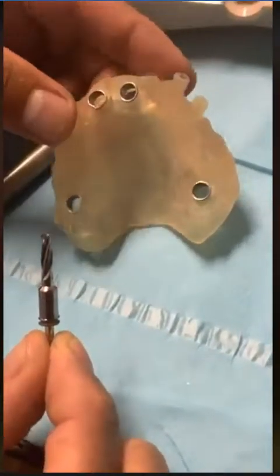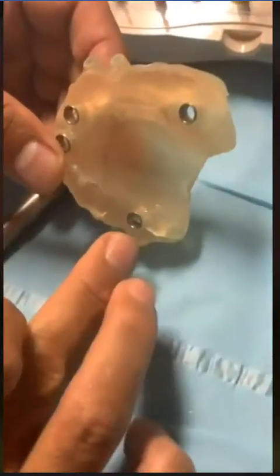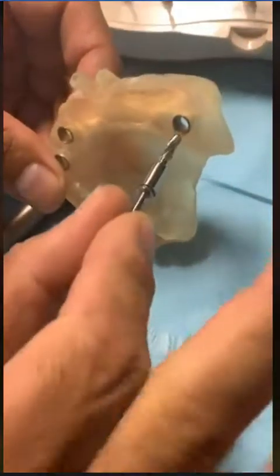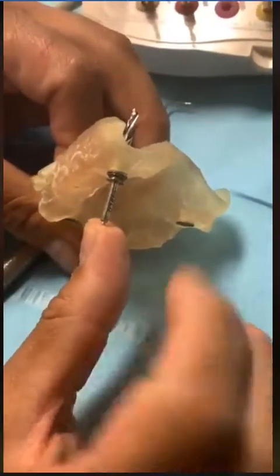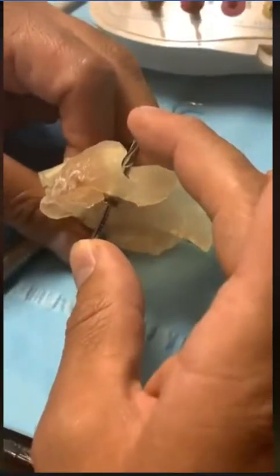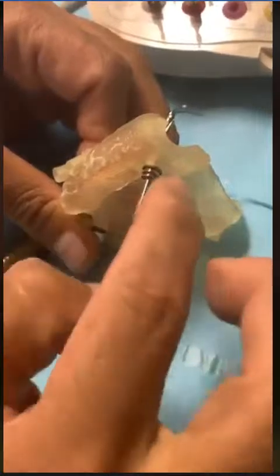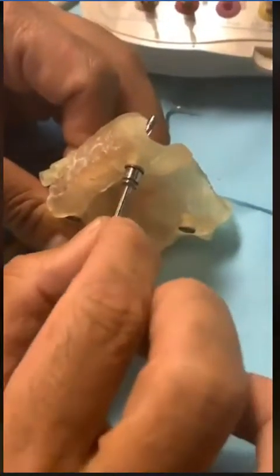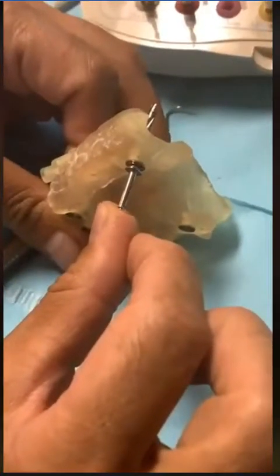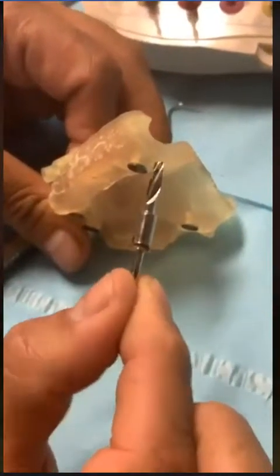Now, what I mean coronoapically means that whether this implant is a 10 millimeter, whether this implant is a 13 millimeter, when I insert this in and it goes all the way to the top, this calculation of an apical coronal portion is made totally with the computer generated on the guide, so that you could put the burr in and it gives you a stopper. That's what it means when it says keyless. There's no key in here, and every single burr has a stopper to it, so it stops, okay?